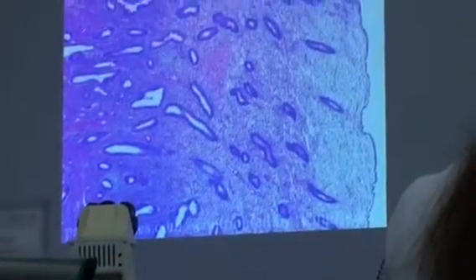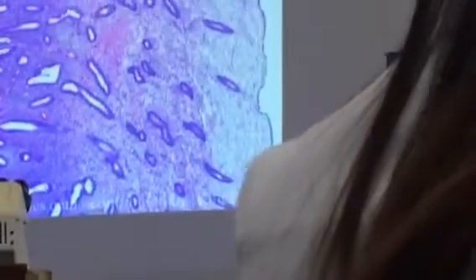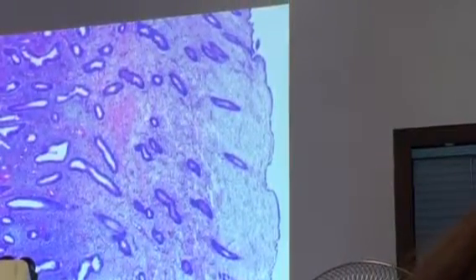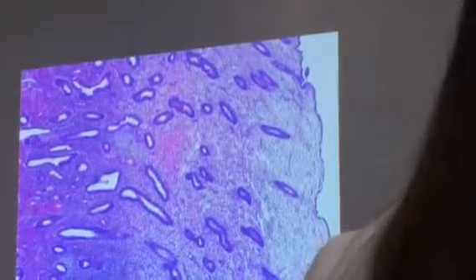They tend to be straight. So when you cut them longitudinally, they look elongated. But if it's cut tangentially or cross-sectionally, they become round. So again, you have to imagine how it was cut. Now, the stroma is compact. It's usually dark staining compared to secretory.